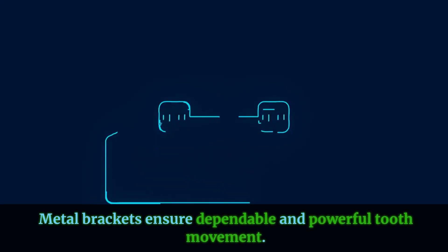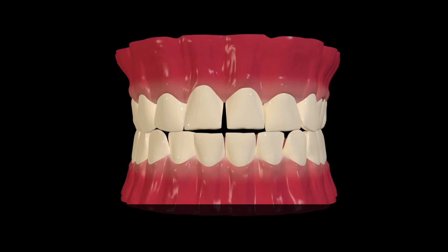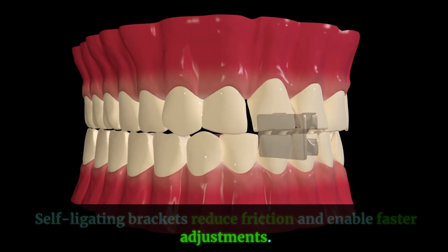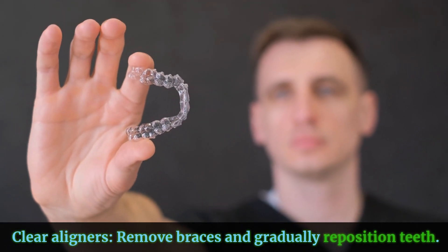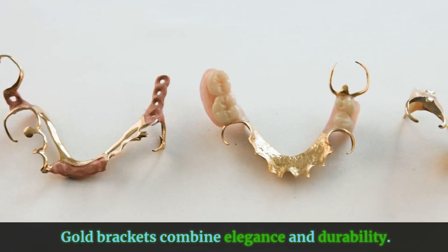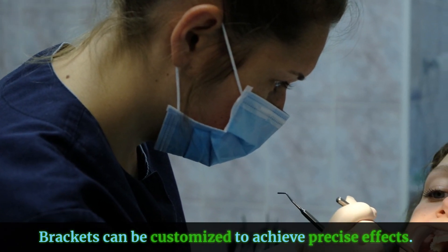Metal brackets ensure dependable and powerful tooth movement. Ceramic brackets provide elegance without compromising utility. Self-ligating brackets reduce friction and enable faster adjustments. Lingual brackets conceal treatment from view. Clear aligners remove the need for fixed braces and gradually reposition teeth. Gold brackets combine elegance and durability. Mini brackets reduce visibility. Customized brackets achieve precise treatment effects.